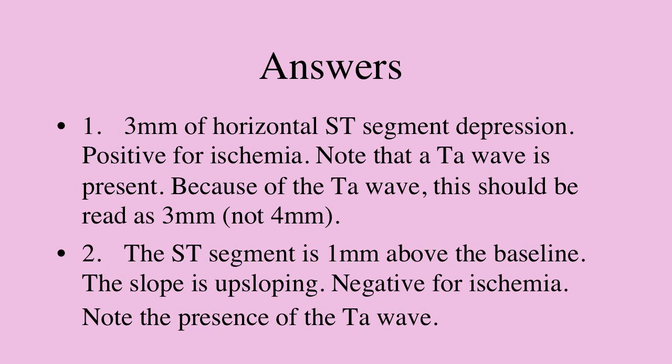There are a few more items to finish under abnormal EKG during GXT, and the first one after ischemia, so number 2, is dysrhythmias. There's an example on page 77 in the course pack with runs of VTAC, ventricular tachycardia. And the statement here is that it's abnormal to induce dysrhythmias or have dysrhythmias increase with exercise. You do not want to induce dysrhythmias or have them increase in frequency from what they were at rest. So if you have somebody with a few PVCs at rest and you have a lot of PVCs during exercise and even VTAC, that's not a good thing.